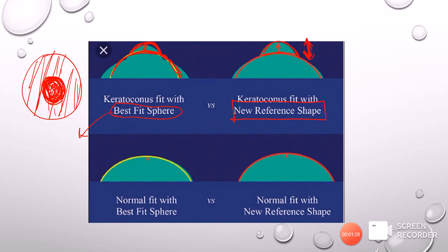Such a new best fit sphere that is calculated by excluding the conical part of the cornea is called the enhanced best fit sphere.